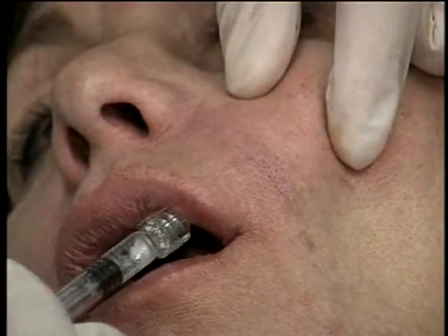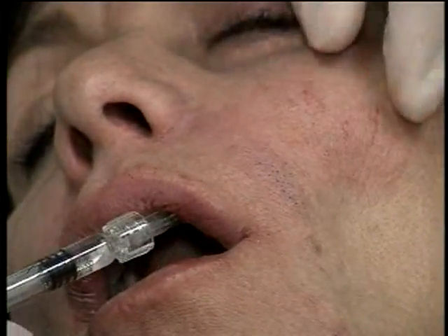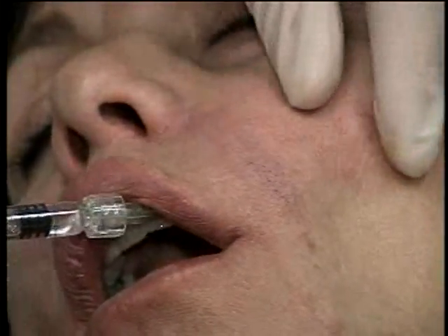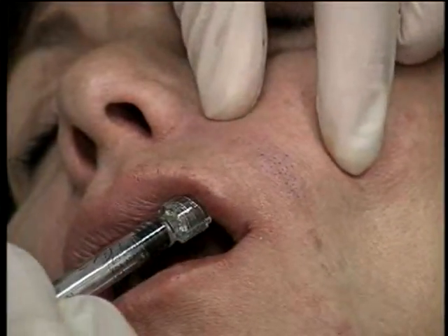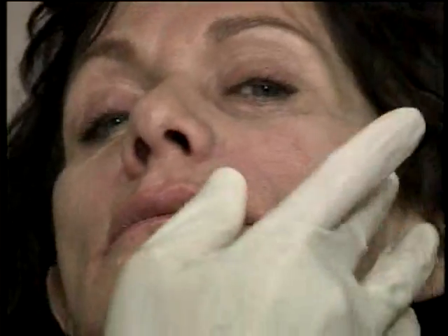And I think it gives a very nice look. So this is something that recently we've been doing. Okay, good. And you can start to see it filling in already. If you look down, you can see how this is filling in here.